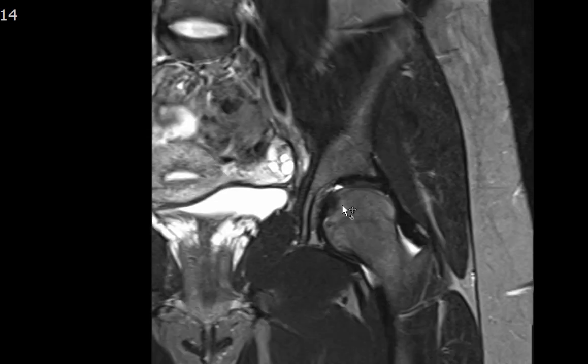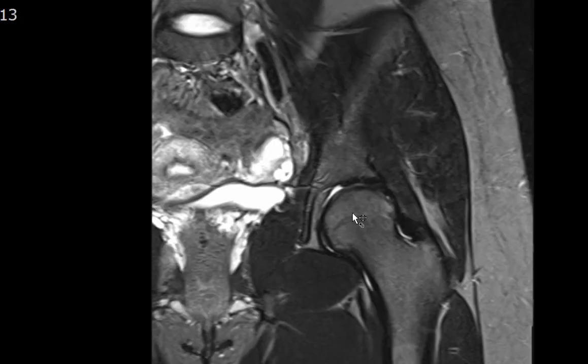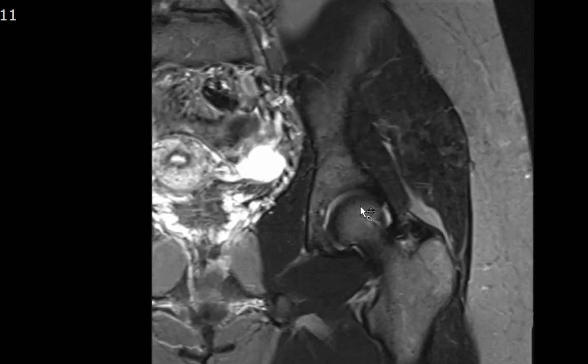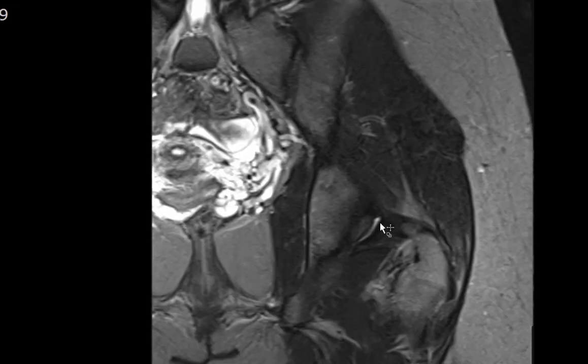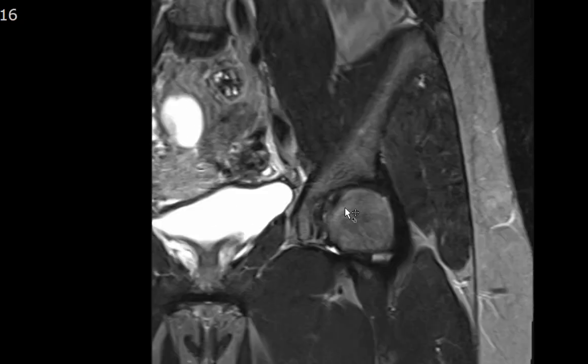There's no evidence of avascular necrosis within the femoral head — no serpiginous abnormal geographic signal intensity to suggest AVN. I can also assess for a joint effusion. There is some physiologic fluid within the femoroacetabular joint, however not enough to call a joint effusion.